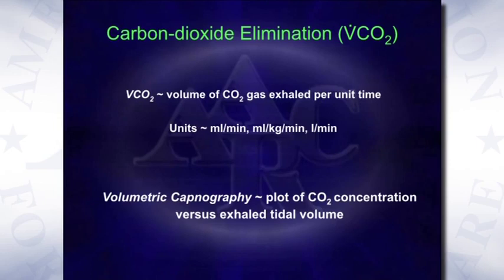So VCO2, which is essentially short for carbon dioxide elimination, is the volume of CO2 gas exhaled per unit time. The units are typically displayed, depending on the manufacturer, either in mLs per minute, mLs per kg per minute, or perhaps liters per minute.